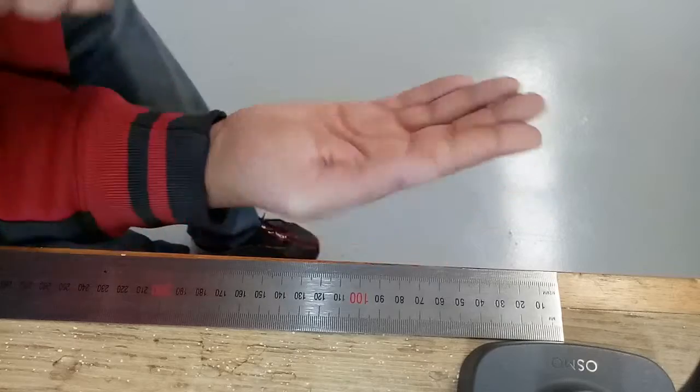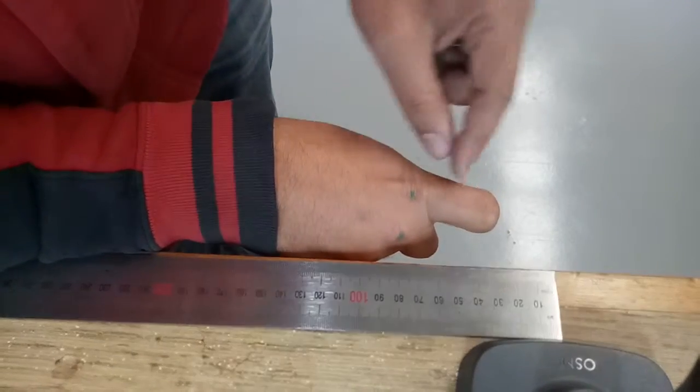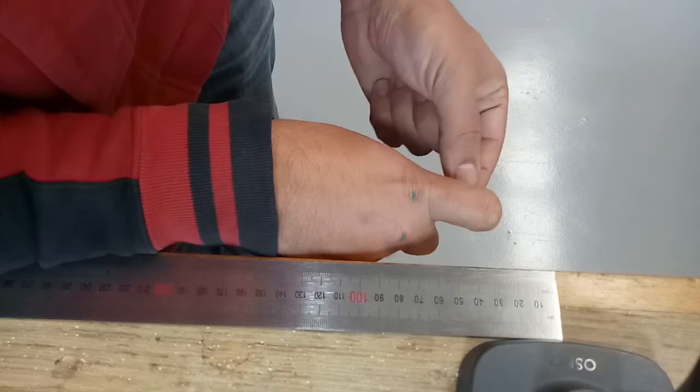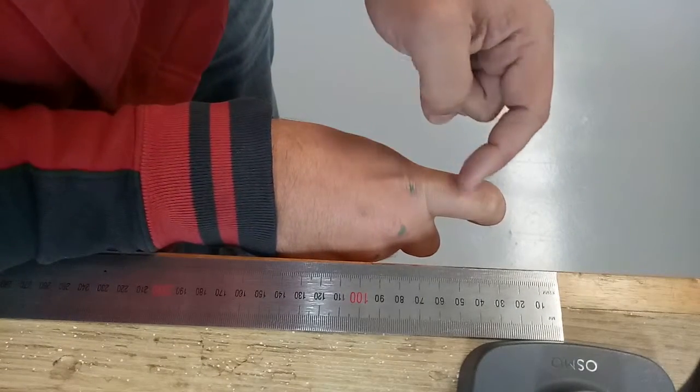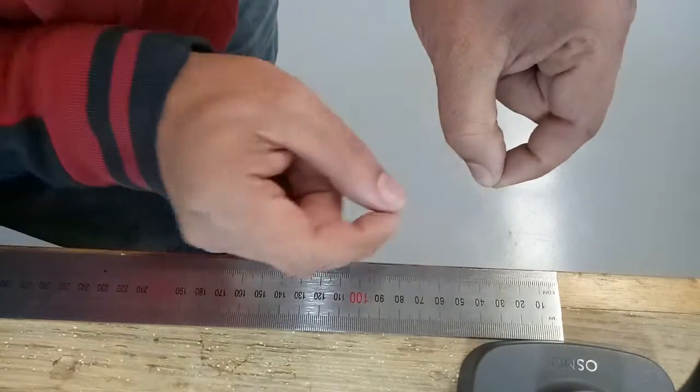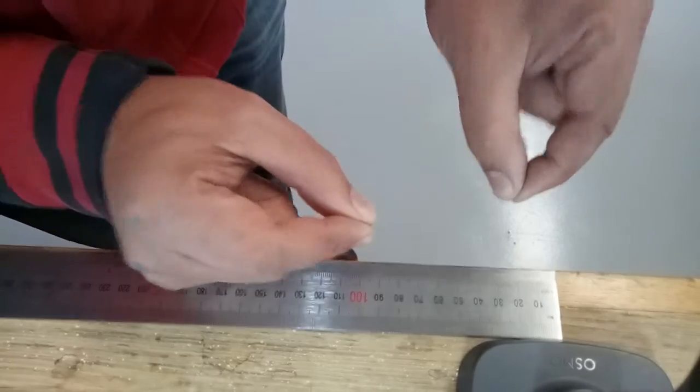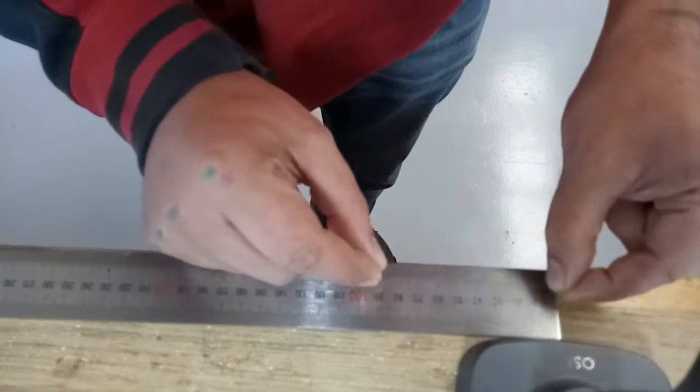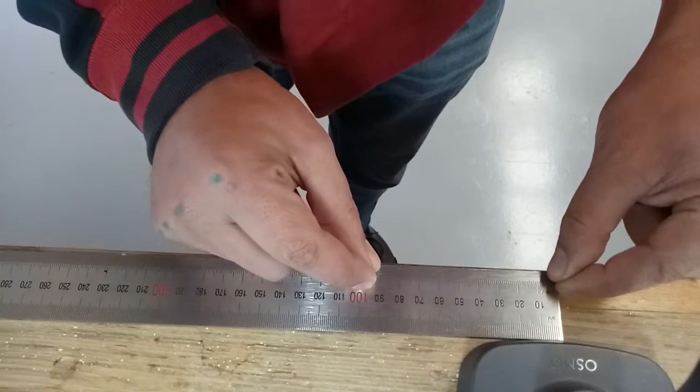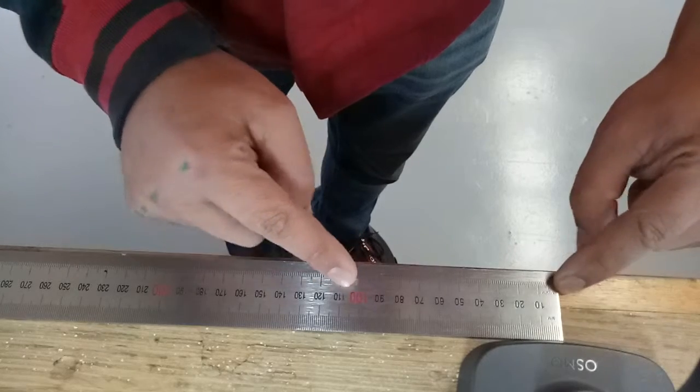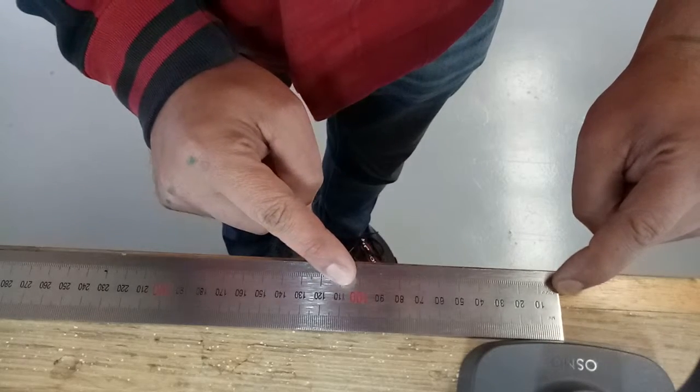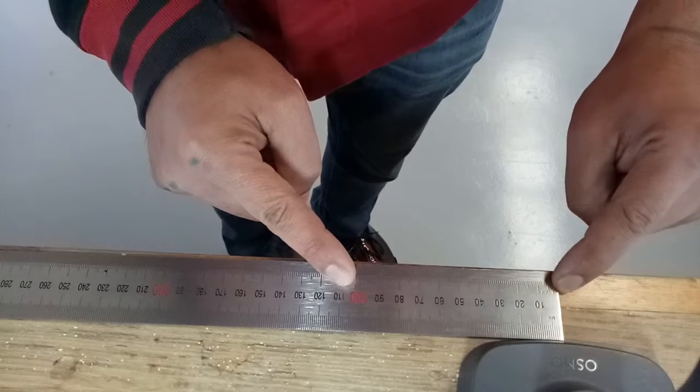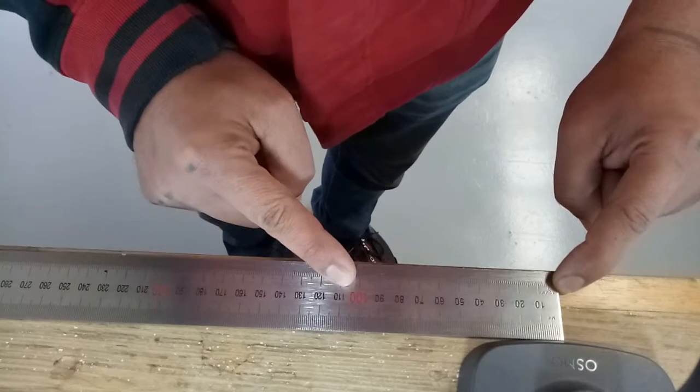And finally for the affected finger, if you can get a piece of cotton and wrap it around the finger, then when you take that length of cotton we'll understand the circumference of the finger. So if you can send the fourth photograph of that piece of string stretched out onto the ruler, we should be able to get a quite accurate circumference of the finger from that photograph.